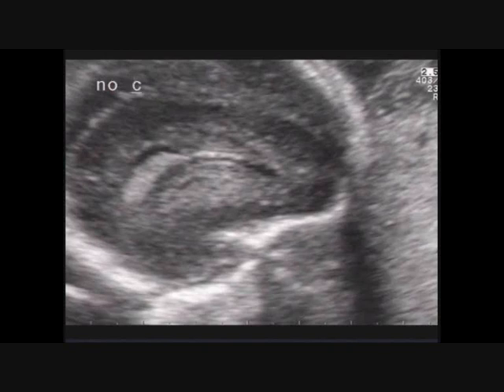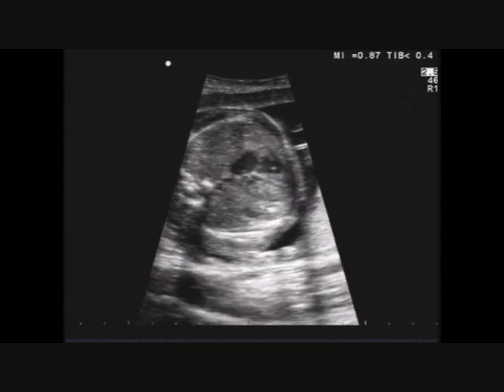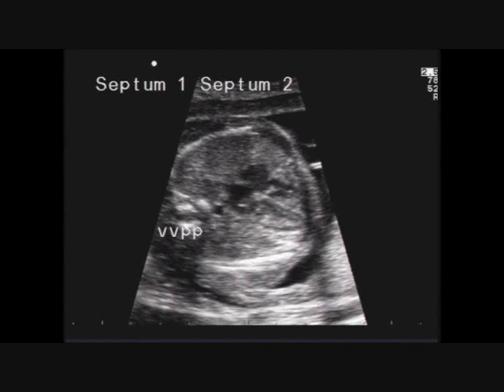In this image, we put the conclusive words after so many scans in which we don't see the corpus callosum. You need to do an echocardiography because in many syndromes there is frequently a heart malformation. You can see the septum primum and septum secundum.